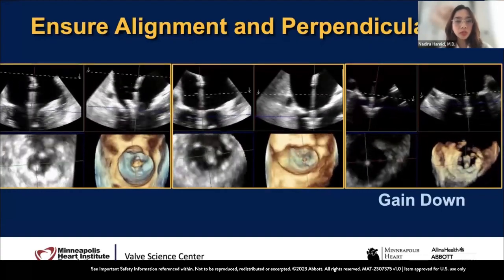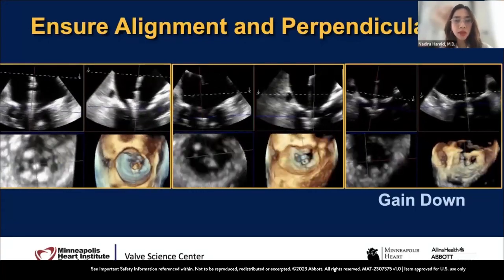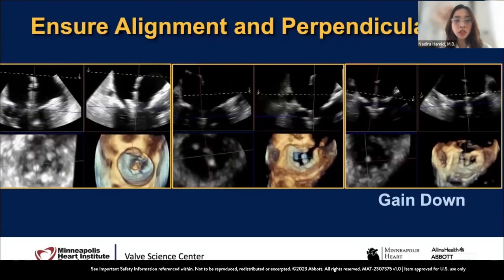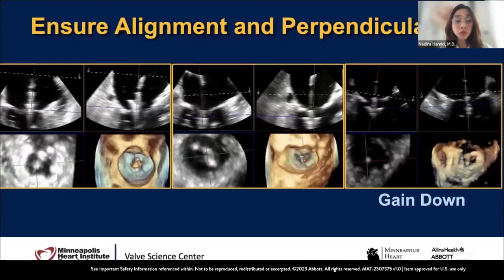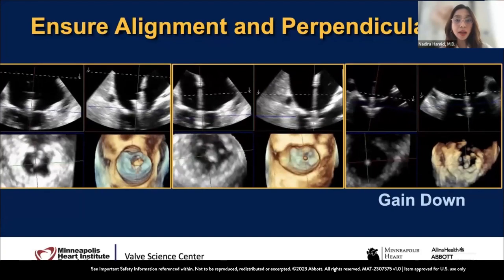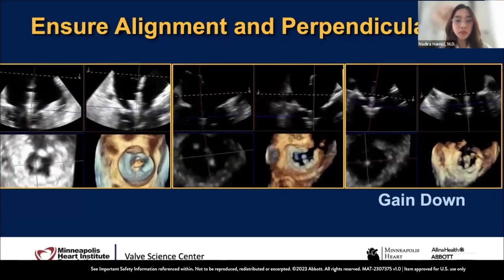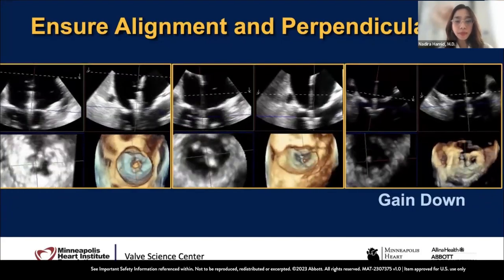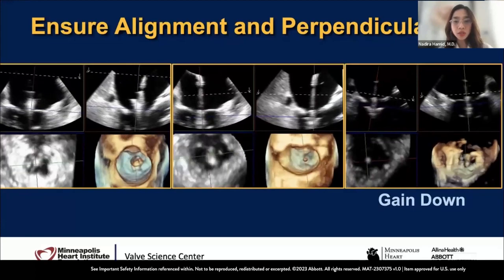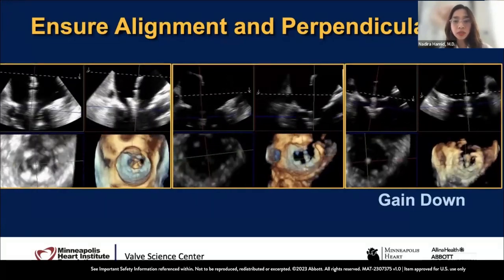Because it's 4 quadrants, you have 2D, both bicommissural and the long axis, and you can see on the bottom row the short axis of the mitral valve. You can rotate it in the surgical view and still remain live. So Ryan can see it as well, and he can adjust accordingly. And you can see on the left-hand side, once it's in the ballpark central, with that same view Ryan would just push down below the leaflets.